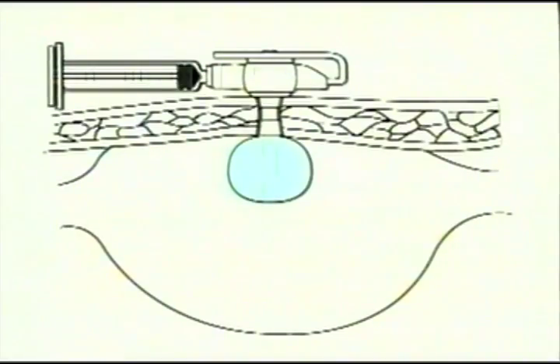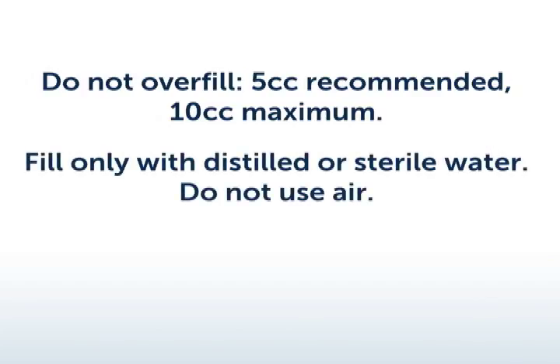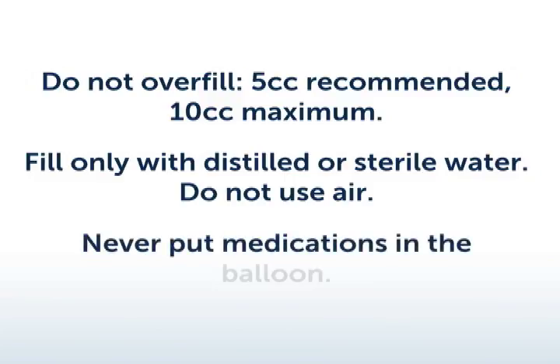The recommended balloon fill volume is 5 cc's. However, your doctor may recommend a different amount. Whatever amount is prescribed, be careful not to overfill it. 10 cc's is the maximum amount. Never use air to fill the balloon. Never put medications in the balloon.